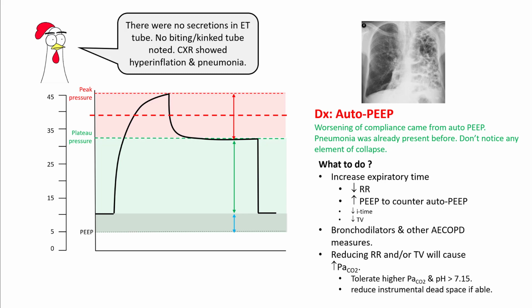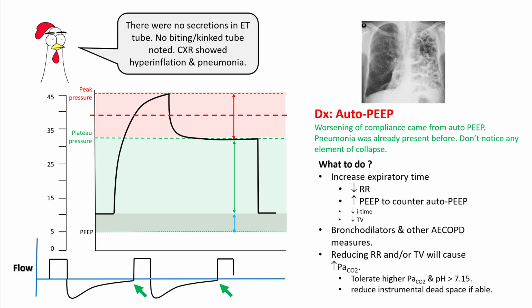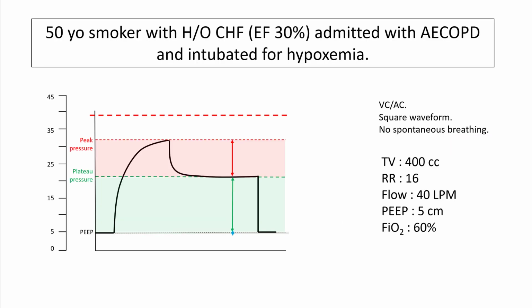If you want, you can look up my previous lecture on how to improve PaCO2. Once you make appropriate changes, your expiratory flow rate should improve. However, it's not always that your flow rates would come down to zero.